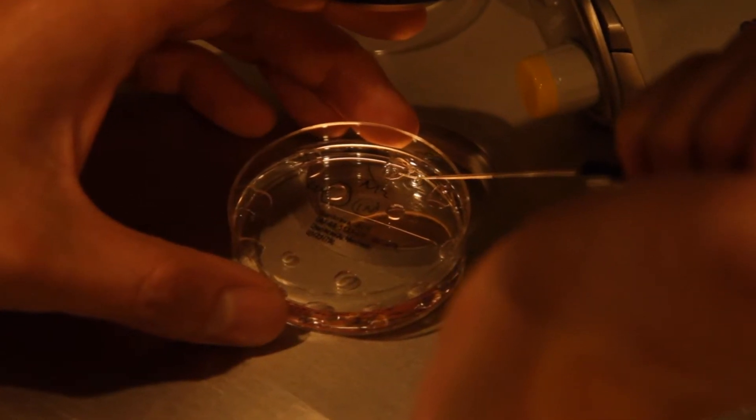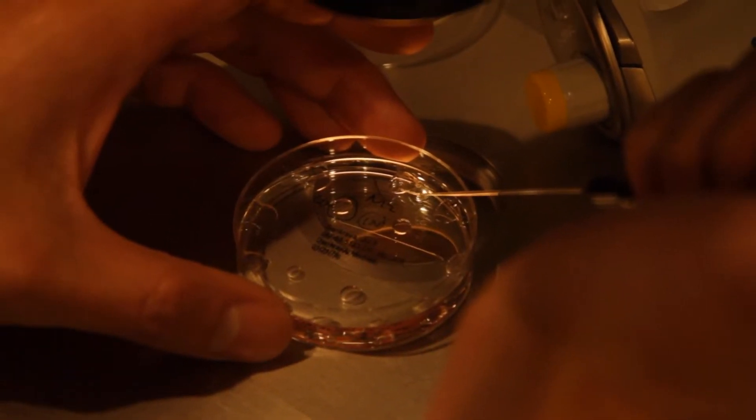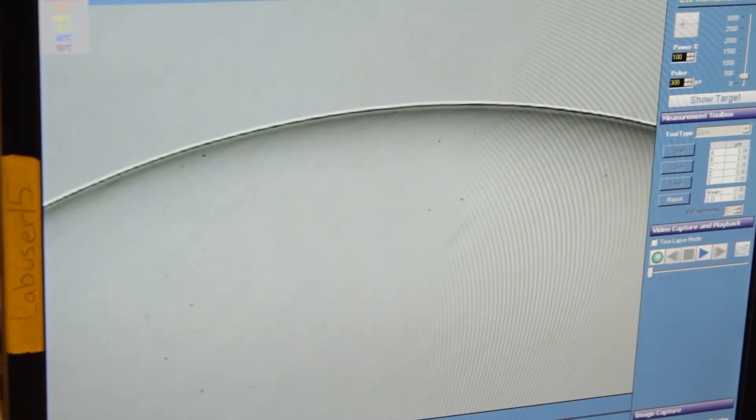Now Donna is going to inject a single sperm into each egg that she has there on the dish. The sperm are placed into a viscous solution called polyvinylpyrilidine, or PVP, and that slows them down.